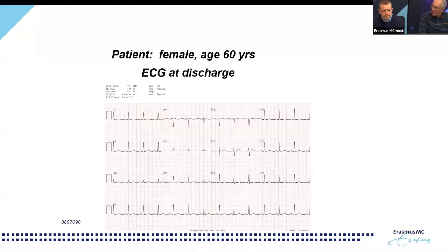Actually, I remember a case where a patient was here with a SCAD, and of course this patient was completely upset because it came out of the blue. And then she heard from the physician, well, we'll do nothing, because this will recover and we will check this after 14 days. But then the patient refused to leave the hospital until she saw the movie. So we sent her back to the referring hospital. You remember that? It was gorgeous, and this patient was very happy and relieved.